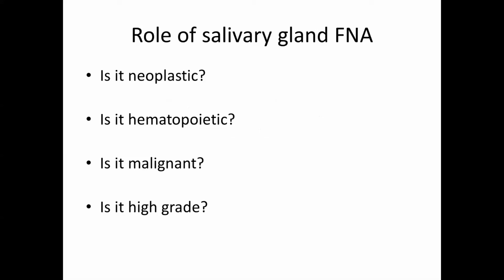And so if you can corroborate a diagnosis of chronic sialadenitis and agree with that clinical impression, that may have an impact in changing management in the sense that they may not resect the lesion.